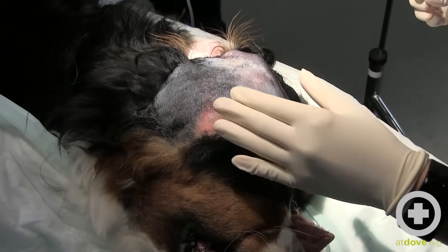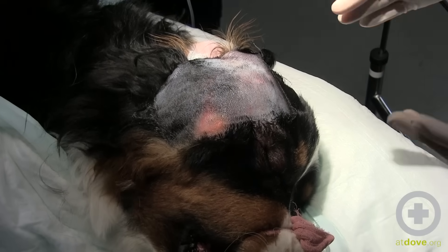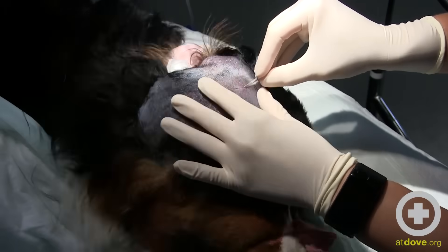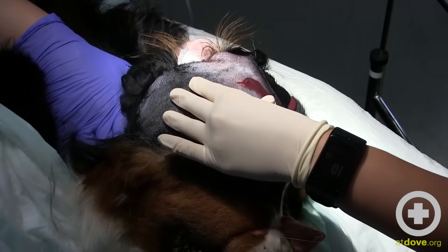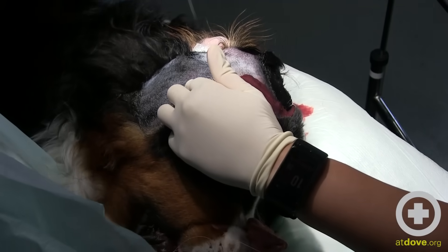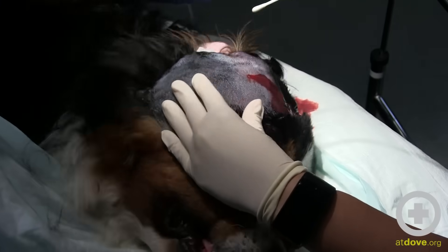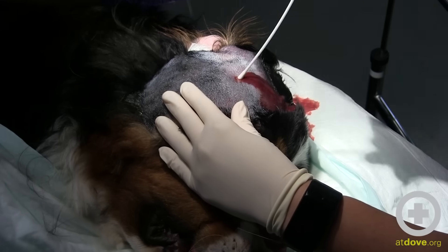I'm going to start with an 11 blade, just a stab incision. We've gotten a lot of preparation here and the abscess fluid — unfortunately she's going to get a bit messy from this. We'll start with a stab incision to establish drainage. She clearly doesn't appreciate that, so we're going to give her a little more propofol. I'll collect my culture sample by inserting the culturette tip right in there.